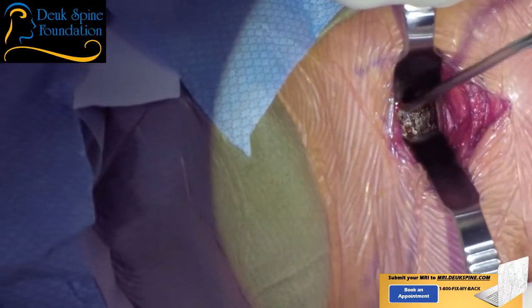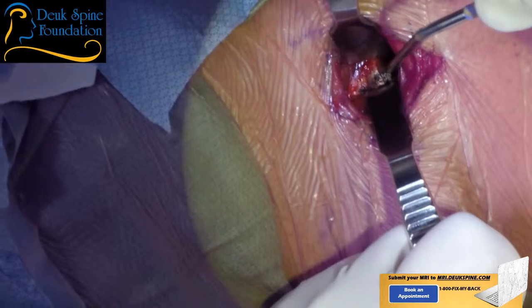All right, where are we bleeding there? Suck all that? Bipolar? Yep, I see it.